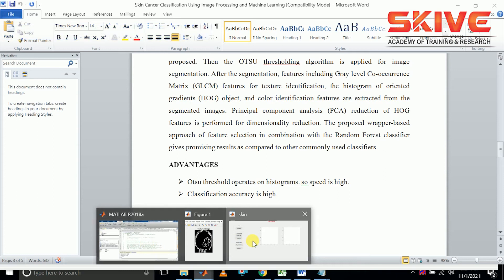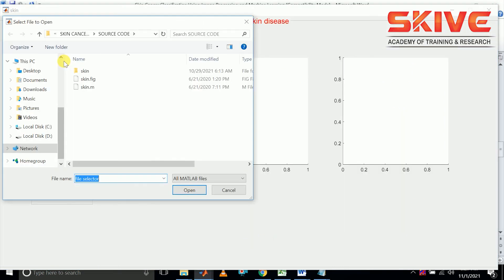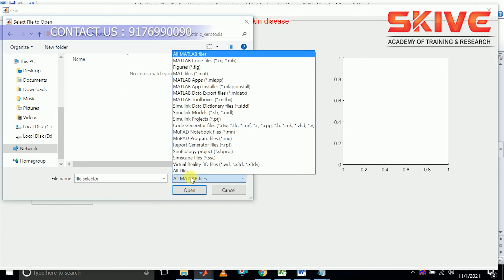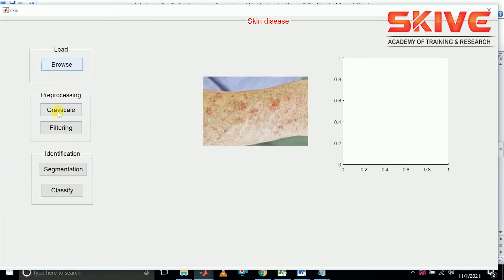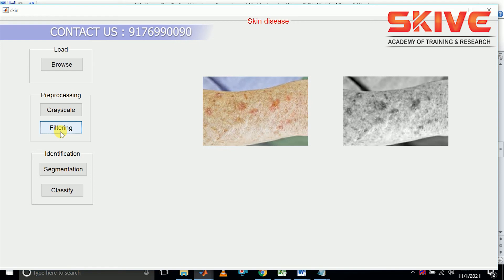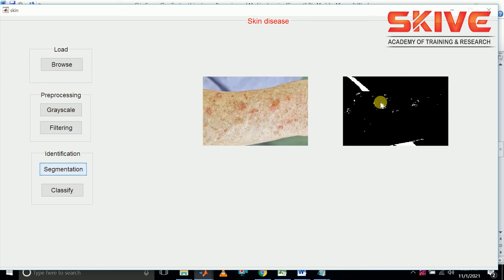Now we are going to see the implementation process. This is the input image. We are going to apply pre-processing steps — the filtering process will be helpful for the next steps. Now we are going to segment the image, and this is the segmented output.